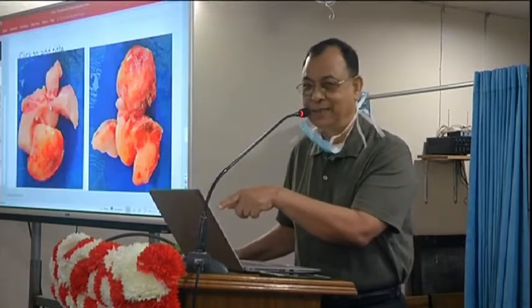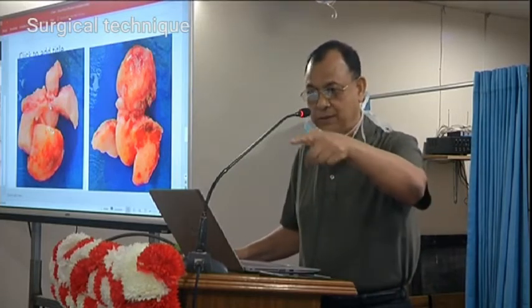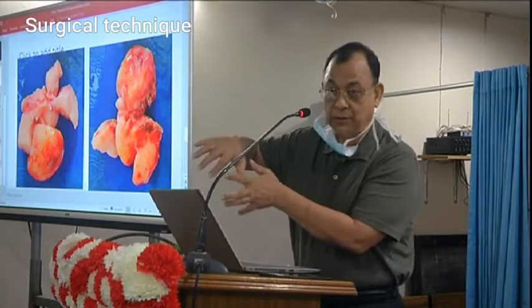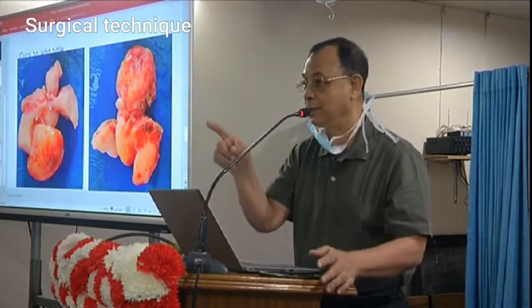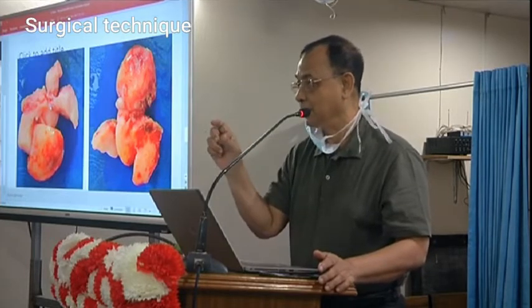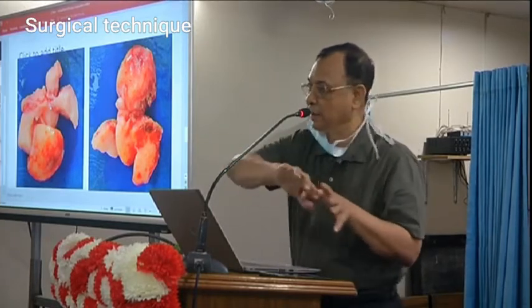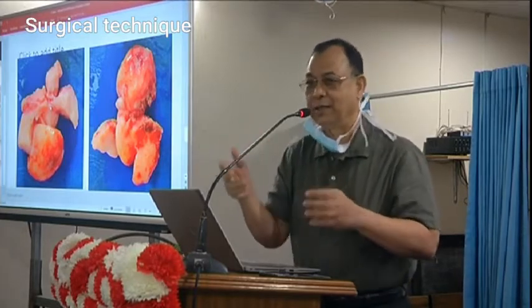So what you have observed here, the area in the sphenopalatine region was cauterized by the bipolar, and at the same time I used the micro debrider so that all the tissue comes out. There is no tissue remaining behind in the sphenopalatine region. That's why I use the micro debrider as well, though it is risky. I have a 120 blade, so you can use the 120 blade on that area to remove the whole of this. And once I used the micro debrider, there was tremendous bleeding.